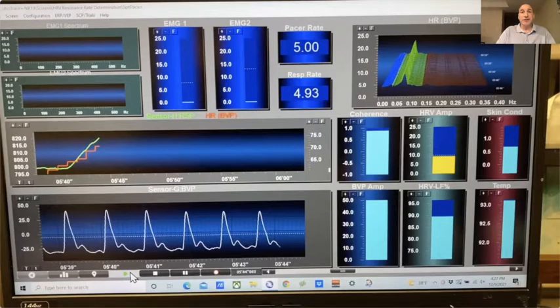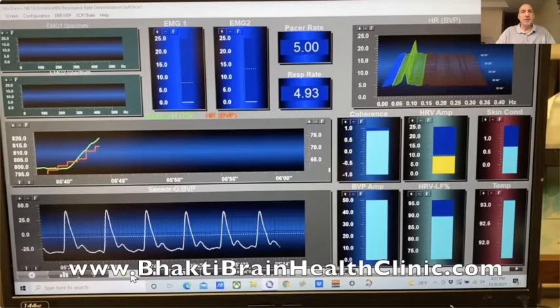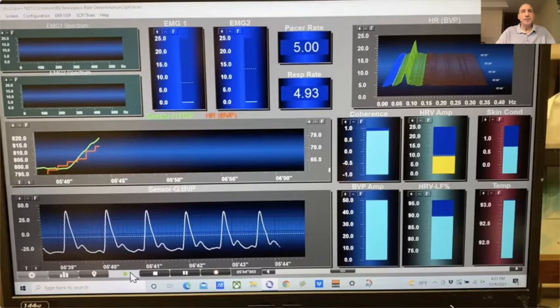The first part of this video you're going to see is a few minutes of the resonant frequency determination, and I'll walk you through some of the metrics on the screen. One of the things that tipped me off that maybe something was up: the resonant frequency determination is about 25 minutes long. It takes people through different breath rates, and that's usually mildly stressing. So we see some wobble in the nervous system as it's being asked to switch from slower to faster paces of breathing. And this person was pretty much perfect all the way through.